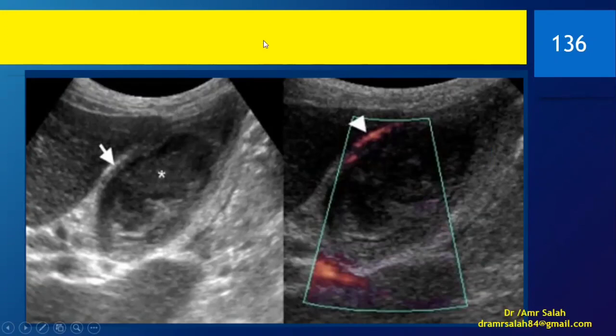Okay, as we see here, we have the cholecystitis. The gallbladder has a very thick wall, and there is fluid inside it. Okay, it might be mud, but there is no stone. Right, this might be pus or anything, but this is not a stone. Okay, and this is hypervascular. Again, this is cholecystitis without a stone. Acute non-calcular cholecystitis. All right.